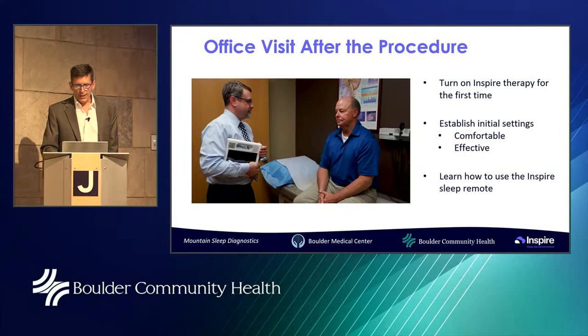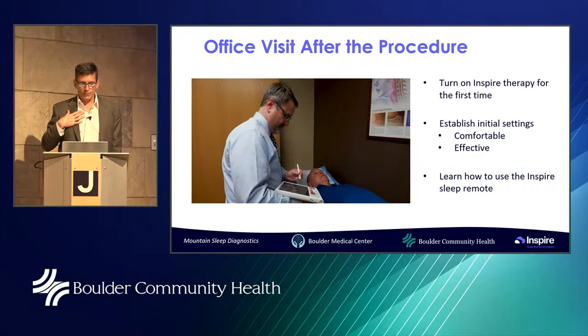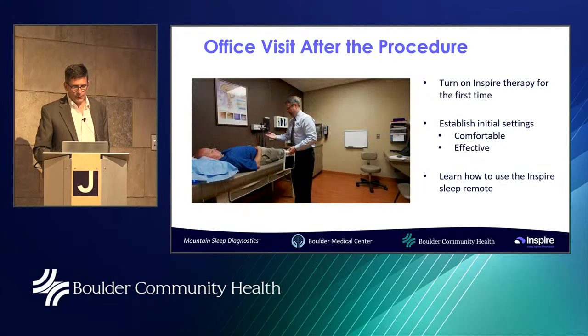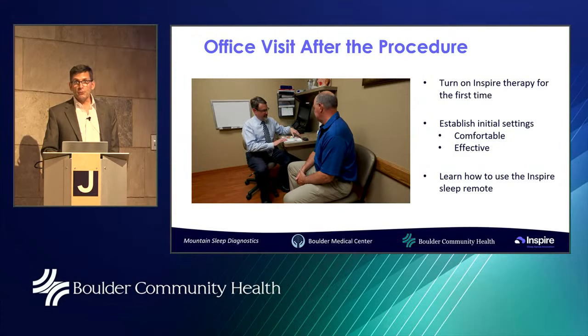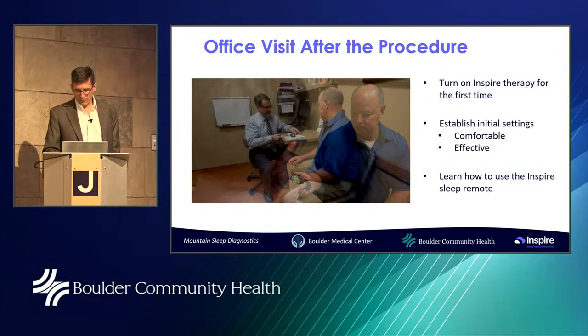After about a month after the procedure, we send you back and you'll see Dr. Miner or someone like this dashing gentleman, and they actually, through the skin, have a device that can read what's going on with the device, activate it, and change the adjustments and settings for it. And they'll check and make sure it's working just right, send you off, and usually after about a month to 2 months, maybe often 3 months, we'll send you back for another sleep study to make sure it's actually working. They'll work with you to make sure you're comfortable with it and so forth and train you how to use it.